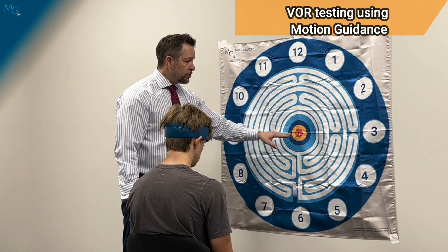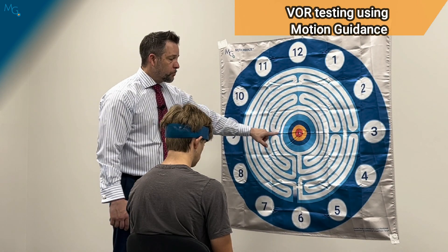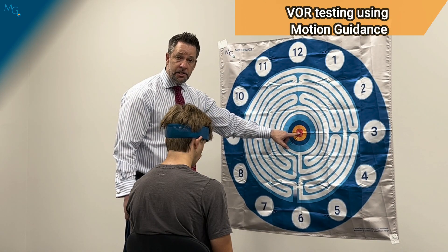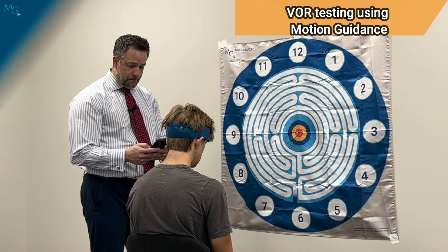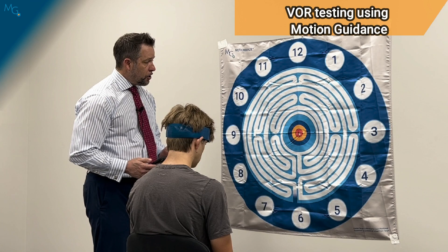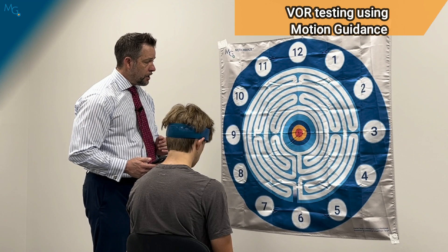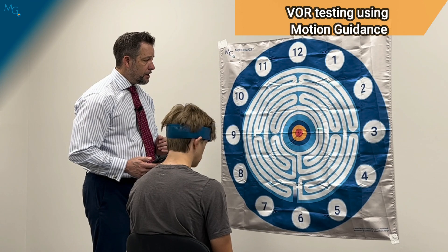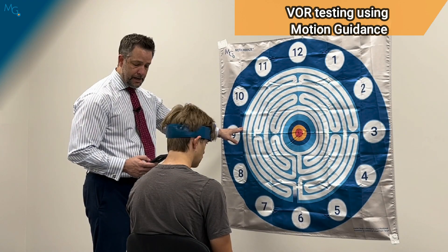The pattern might show up like this: they're set up correctly, but when they start going back and forth with the beats per minute, they do not come all the way to the left with the laser — they come all the way to the right and then maybe just back to center or past center. They dominate toward the right side and never come fully back to the left side.